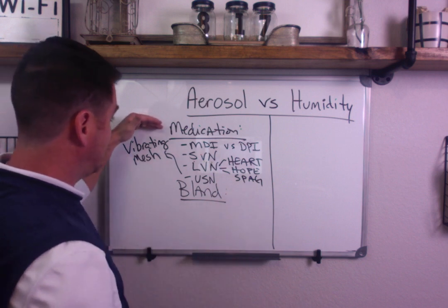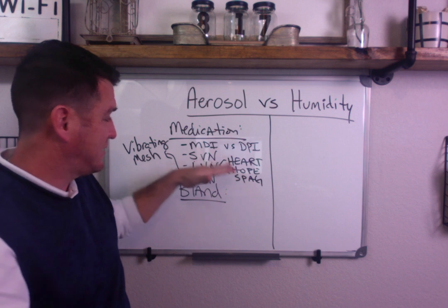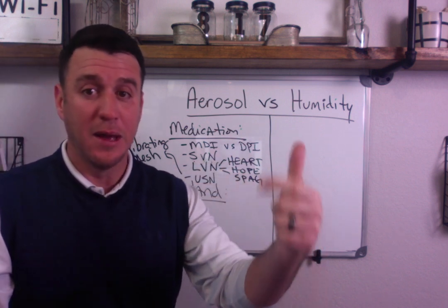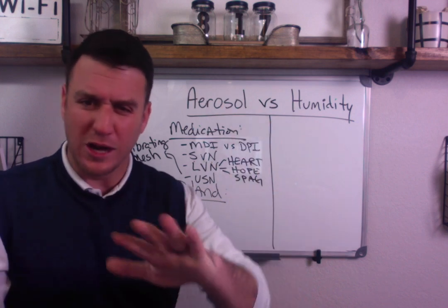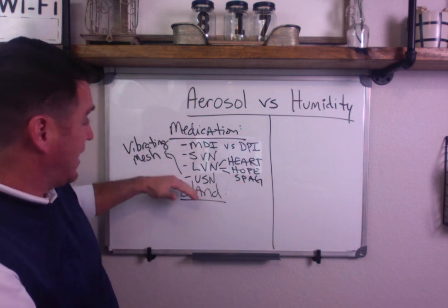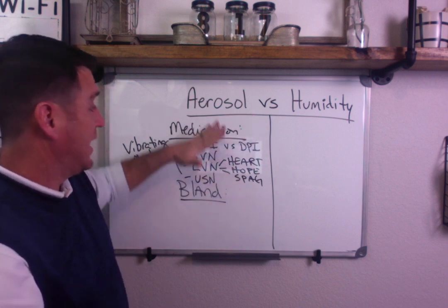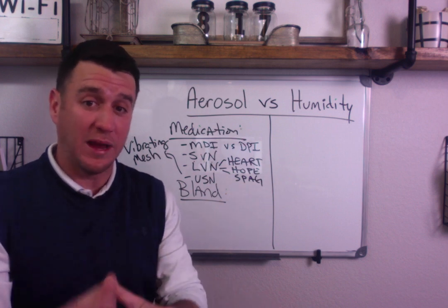These are the medication devices associated with aerosol therapy. There's more. We could break SVN therapy down to continuous aerosolization, breath-actuated aerosolization. A lot of different breakdowns. But for the general macro of things, this is a good starting breakdown of medication delivery aerosol devices and how we give them and when we should give them. Okay, now from there we have to talk about aerosol.